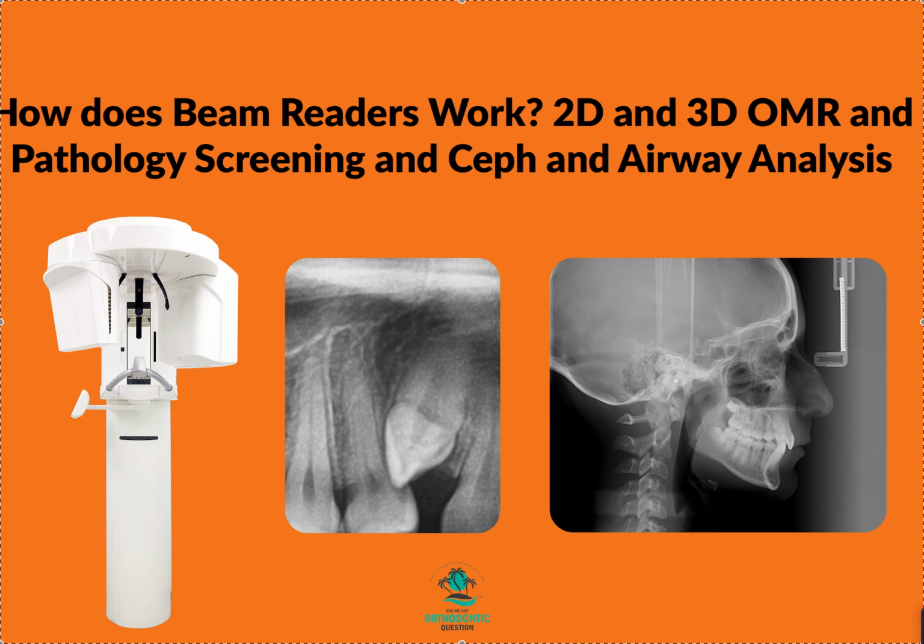So that's the image portfolio, image technician. You can either upload a whole CBCT and get a Ceph slice, or if you just have a 2D Ceph, you can just upload that and have them do whatever type of Ceph analysis you want. Takes a few days, price point more than 50, less than 100.